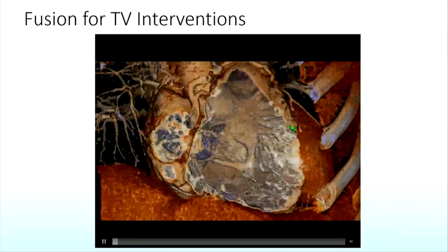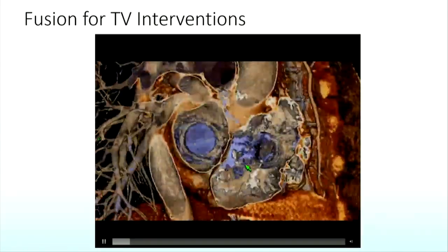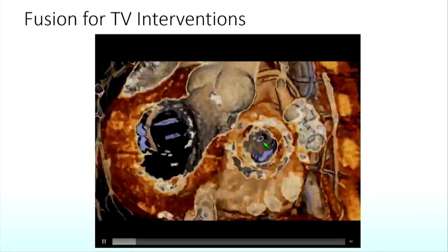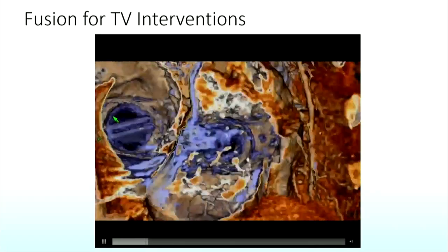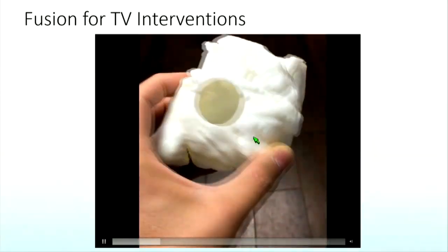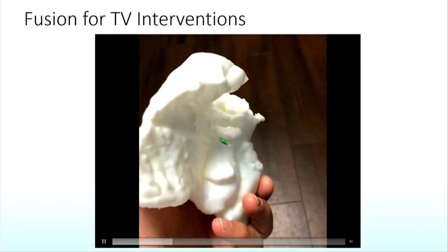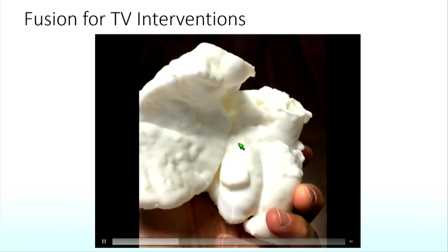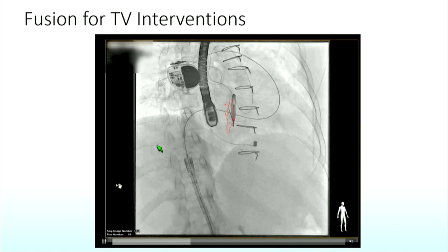So how does this look? This is an early tricuspid valve-in-valve intervention at our institution with a failed tricuspid biological valve, and a patient had a mechanical mitral. But you can reconstruct the CT, this sort of pre-procedural plan. You can print models now to help choose valve or type of device deployment, as well as direction of access.